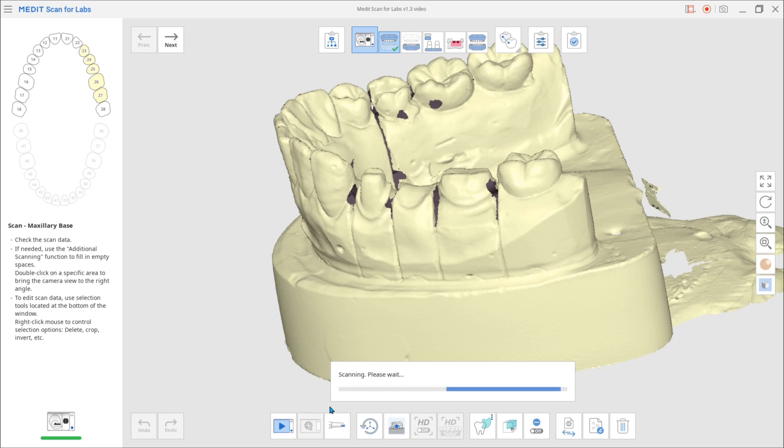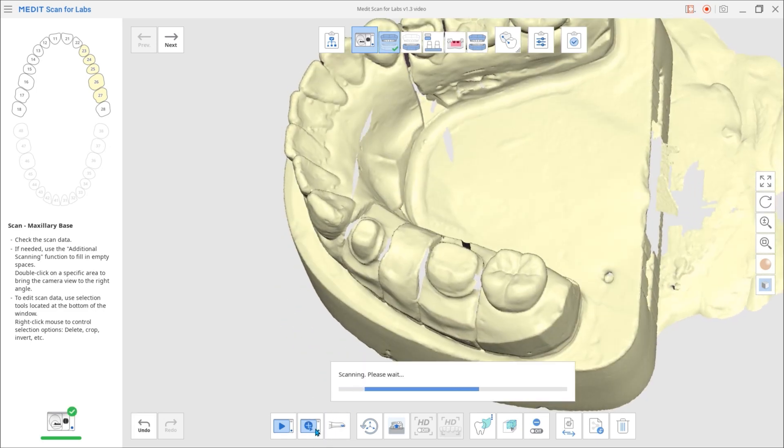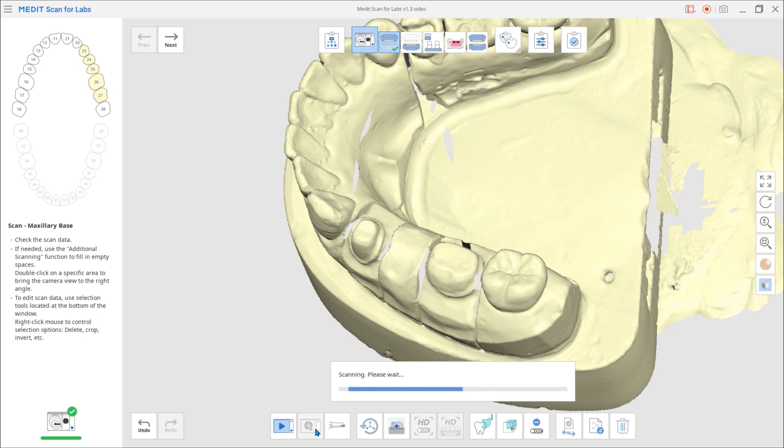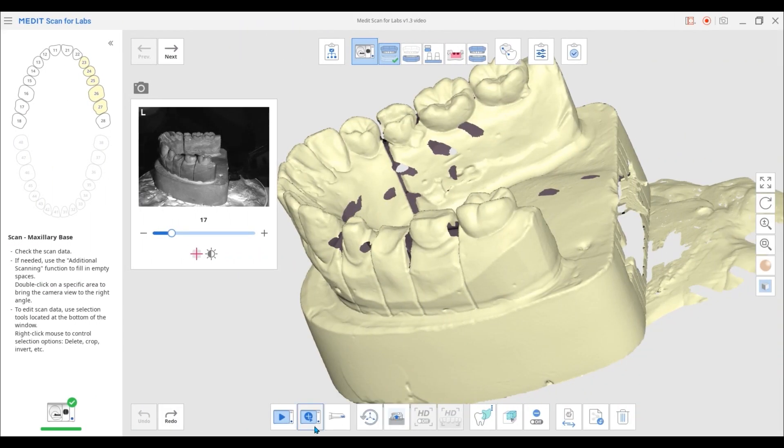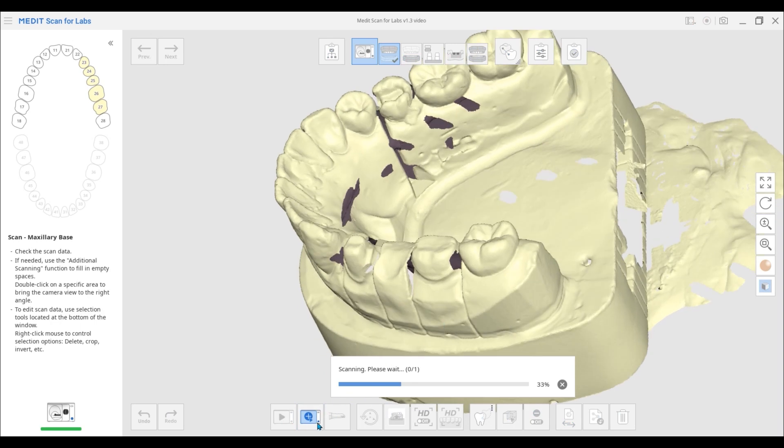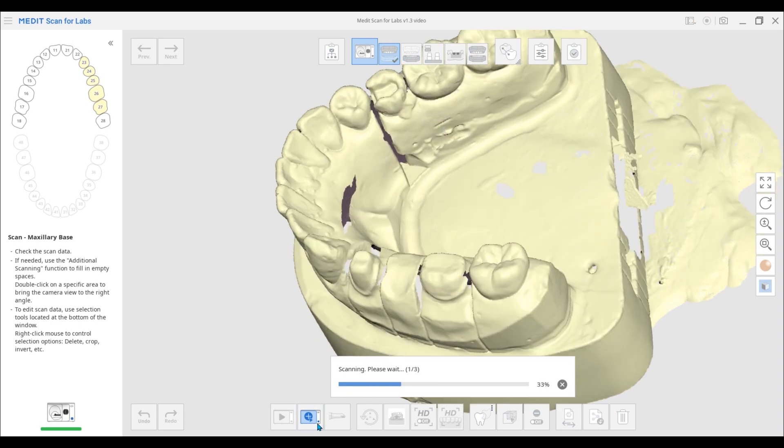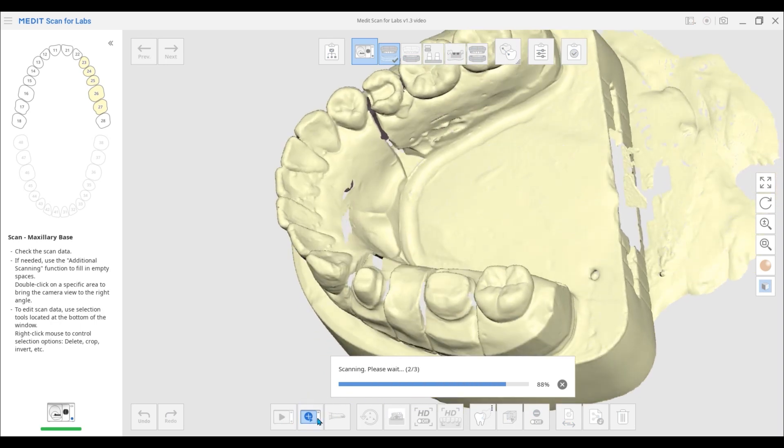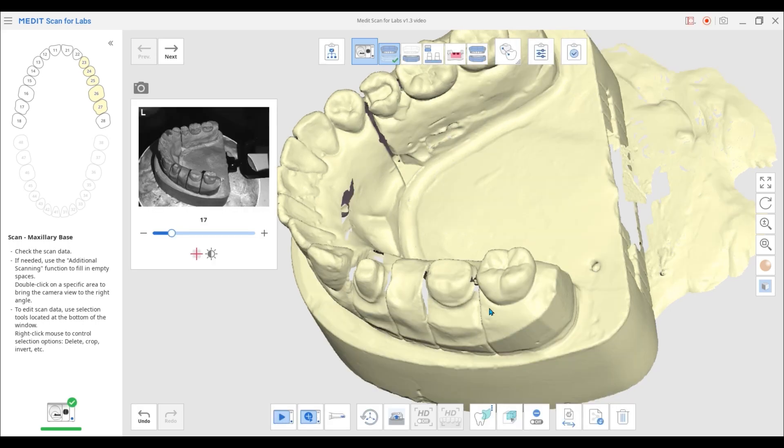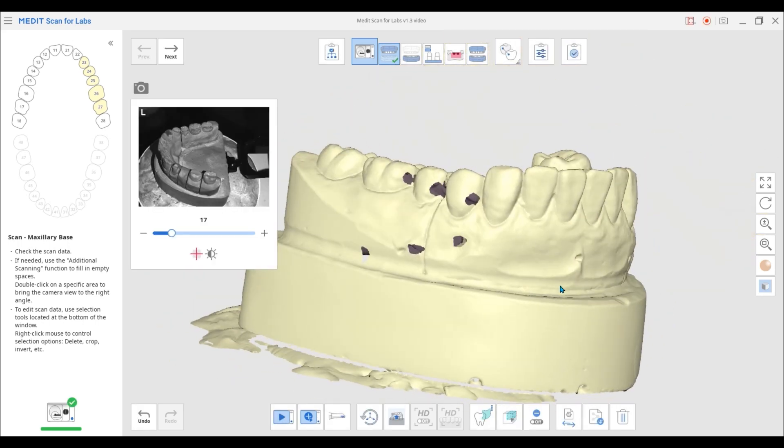In the previous version, users had to wait for the scan to be completed before switching to the next scanning angle. Now in this new version, the current scanning runs in the background, allowing users to freely move the data and add new scanning angles in a queue.